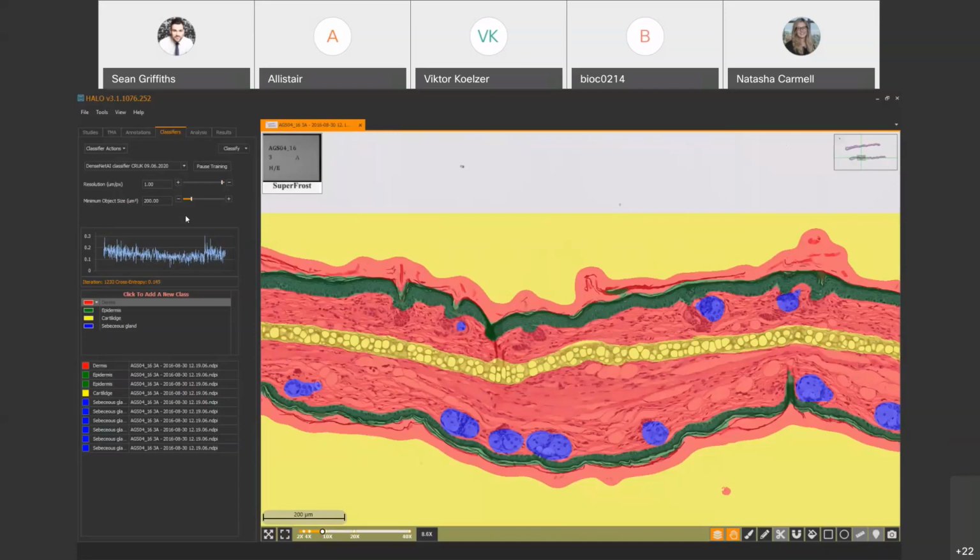Okay. And do you know how when you were clicking around, you managed to get a square around each detected nucleus? If it's got it wrong, is it possible to just reallocate it into a different class? No, sadly not. You can't go, well, that one should be in here, and just stick it in.